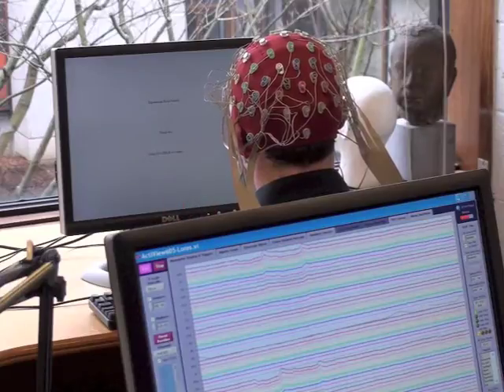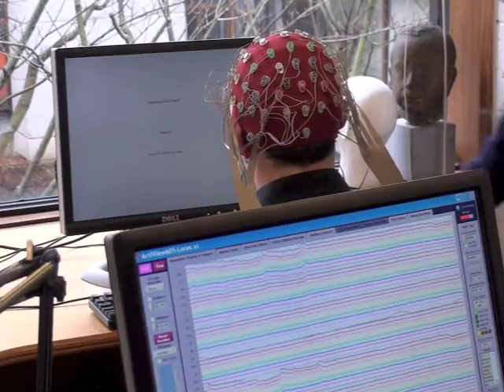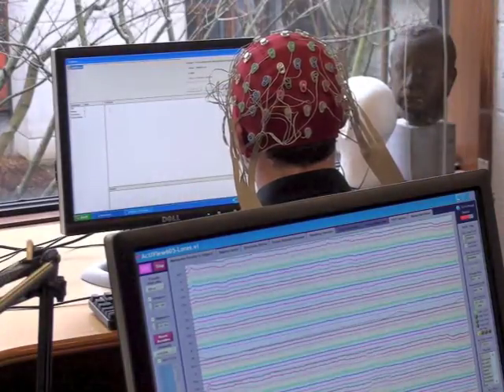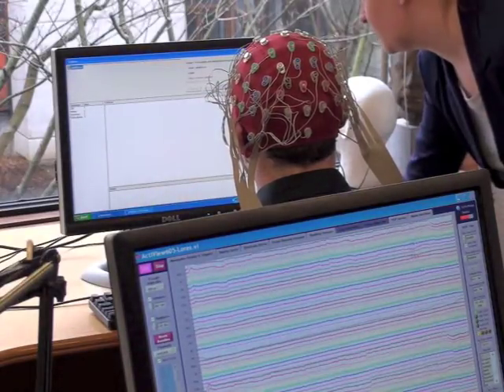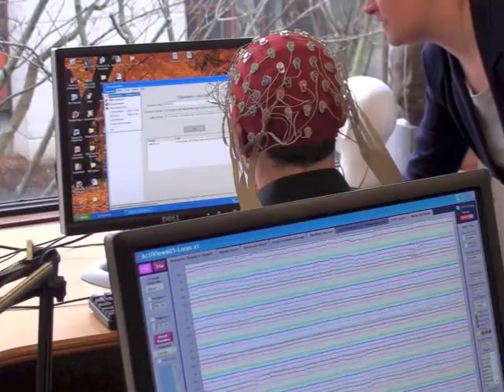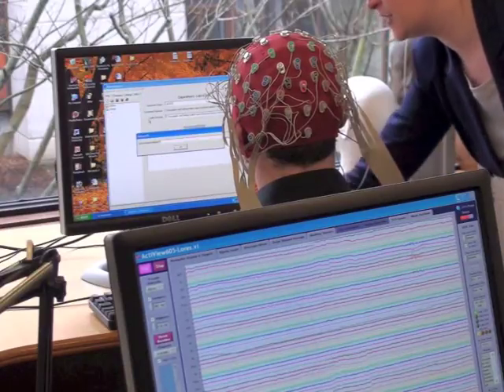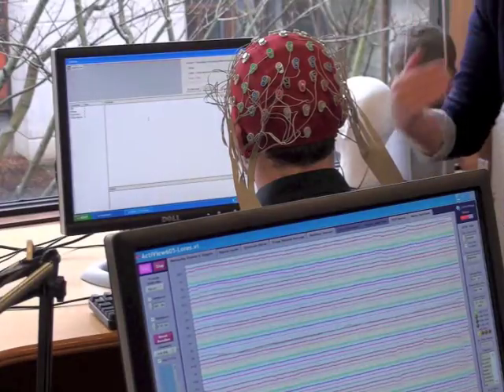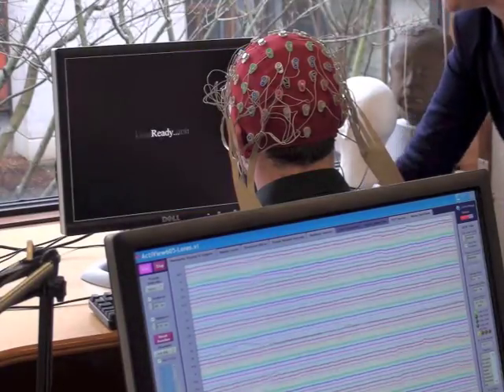I only have a few set up, so I'll keep setting it up again, because I do need to show there's something else. And obviously, as I said earlier, you need hundreds of trials per type of stimulus because you need to filter out the noise, okay?